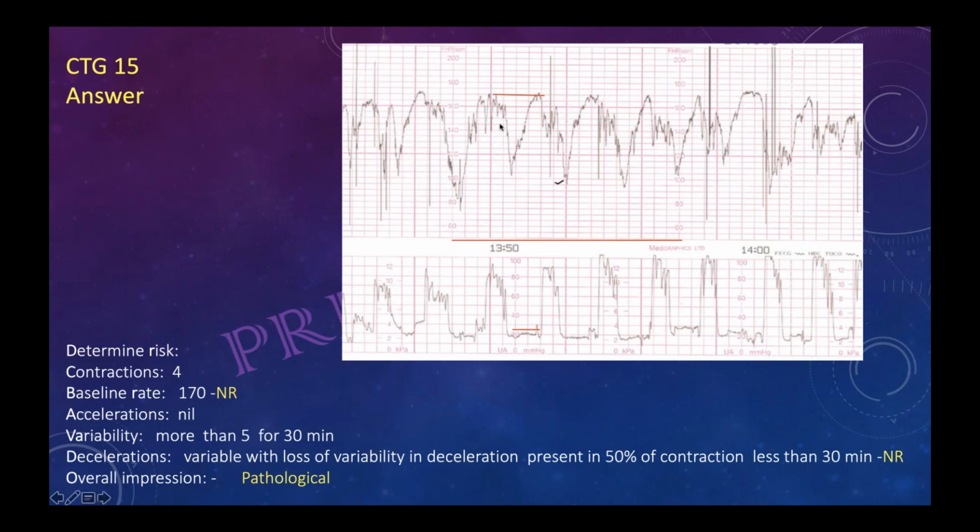Sorry, ma'am. One more question, ma'am. I was present at that time also, but ma'am, you said some vice versa. Two things you said. Okay, if it is less than 50% of contractions and more than 30 minutes, if it is more than 50% of contractions and less than 30 minutes. Yes. This thing I want, ma'am, to revise by you.